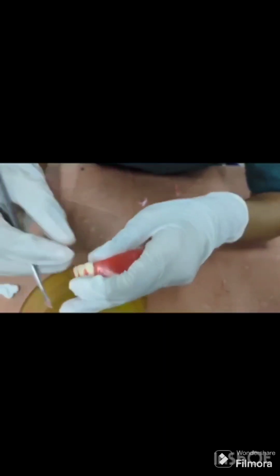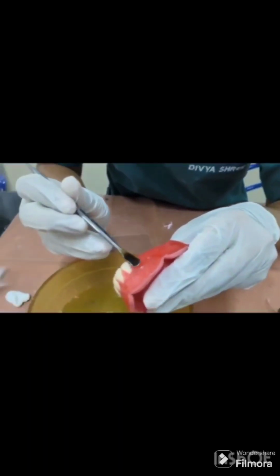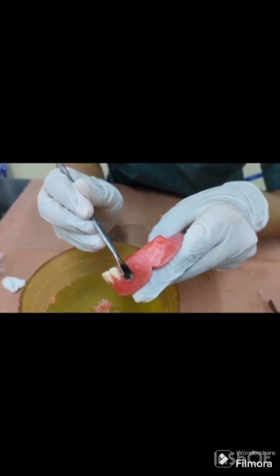This makes the tooth look narrower and enlarges the embrasure. It is inclined labially about 20 degrees when viewed from the side. The lingual view reveals distal margin overlap of the central incisor by the mesial surface of the lateral incisor due to its inclination. The distal surface of the lateral incisor follows the curvature of the arch.